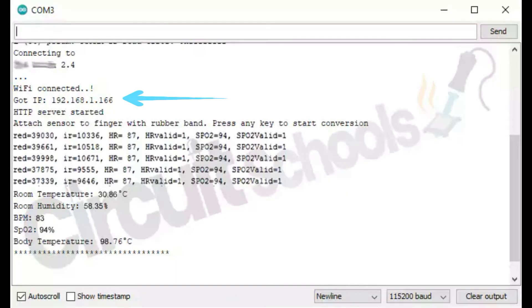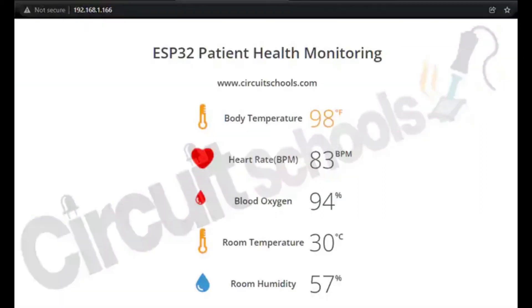Now open the Serial Monitor to check the IP address and a few data values as shown. Next, open any browser from a mobile or PC connected to the same network and enter the IP address to show the health monitor dashboard.